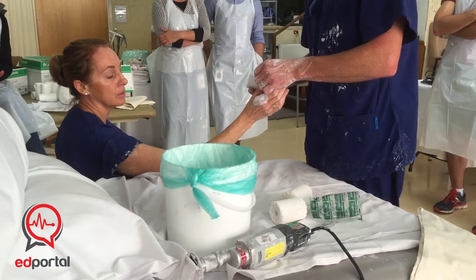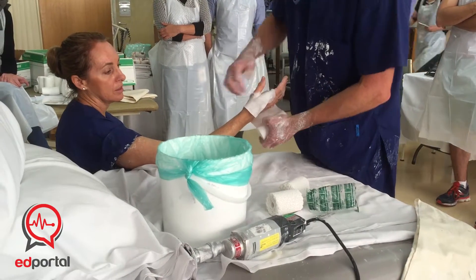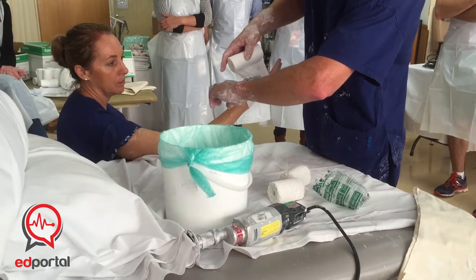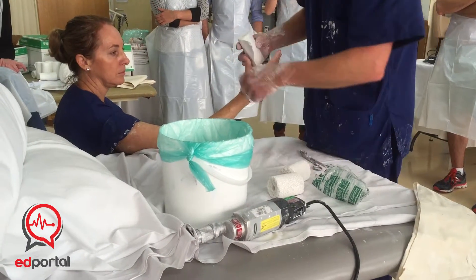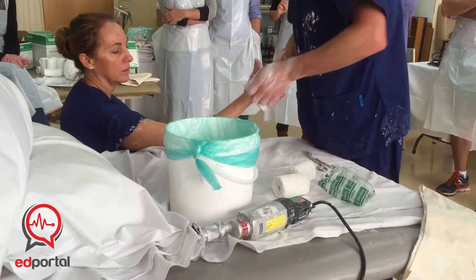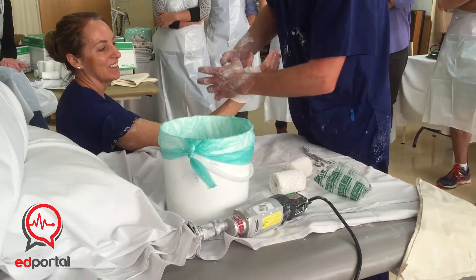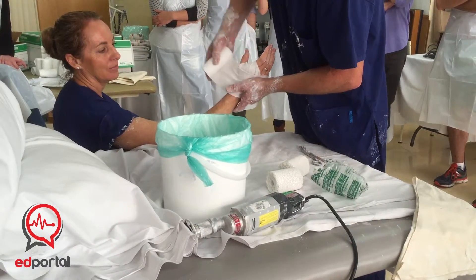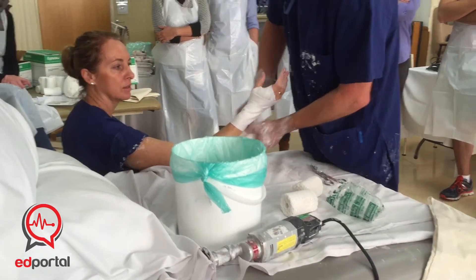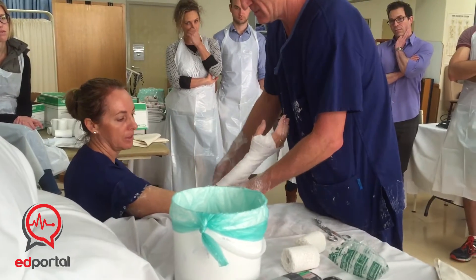Same wrap as before — you can lower the elbow for the first bit, and then we just wrap the thumb. They'll keep moving their hand back and you've got to keep moving it. So it's thumb up to the IPJ — we'll go past that with the web roll and then fold that back as well.